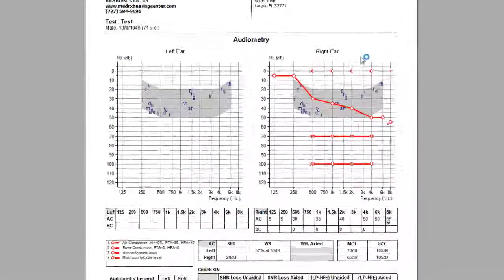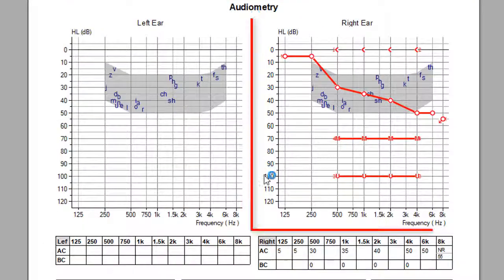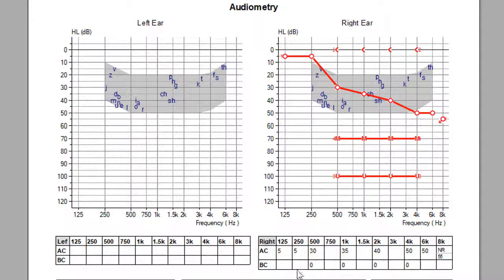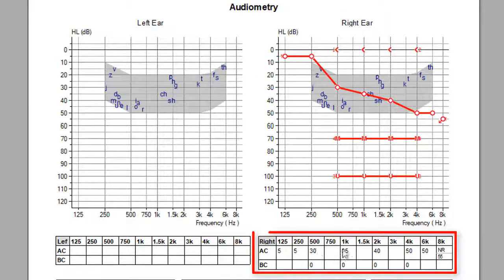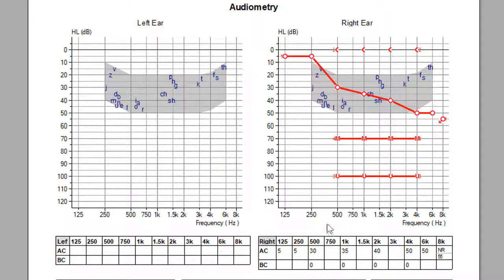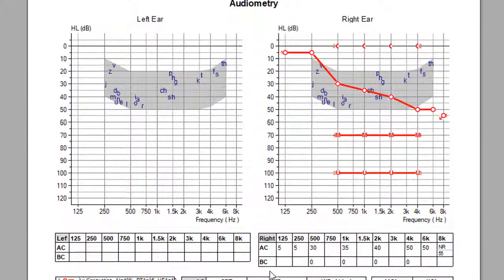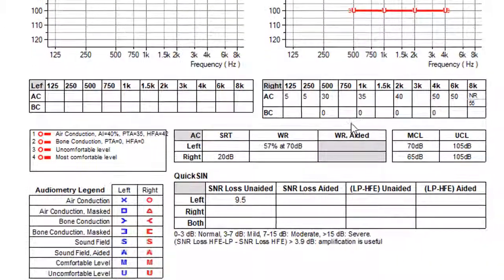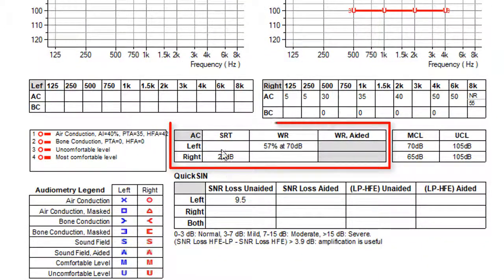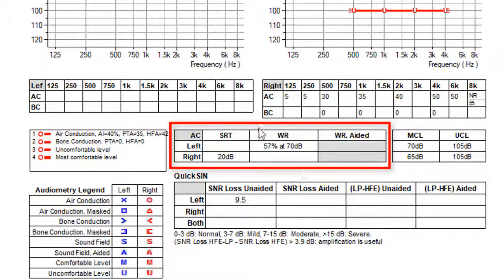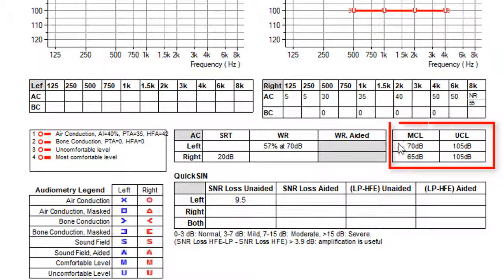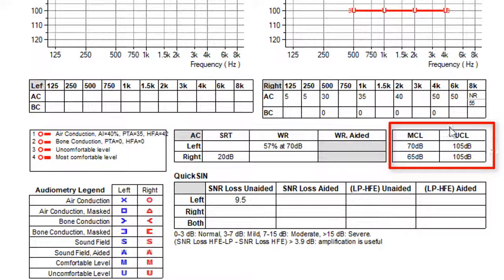So we did everything on the right ear today. So we have your audiogram, your air conduction, bone conduction. If we did any type of masking, all of your masking data would be down here as well. We did an SRT at 20 dB in the right ear, left ear word recognition percentage at the specific dB level, and the MCL and UCL dB level here.